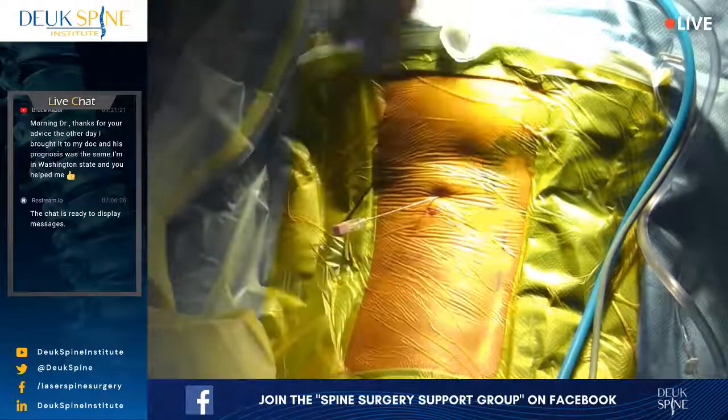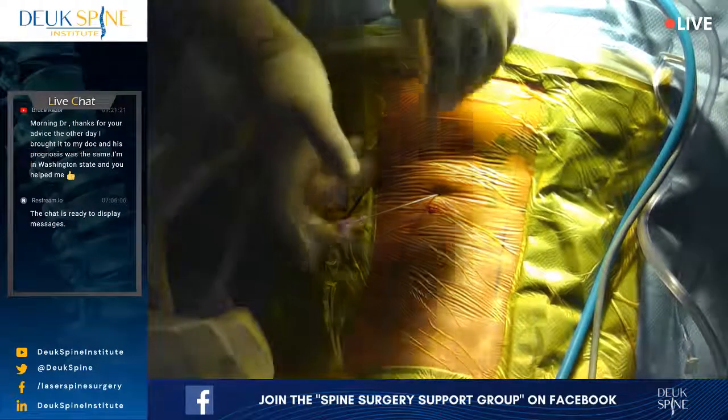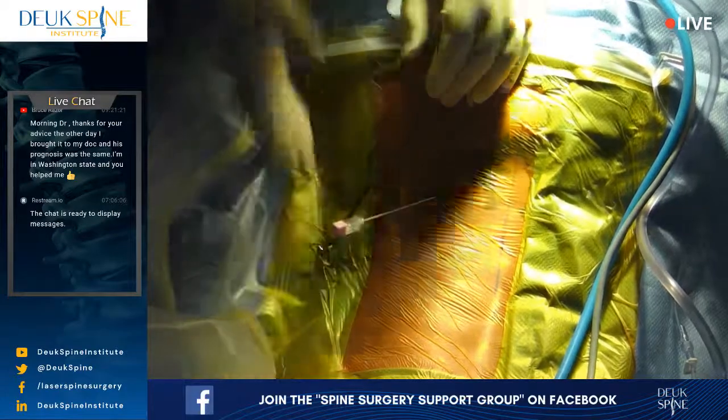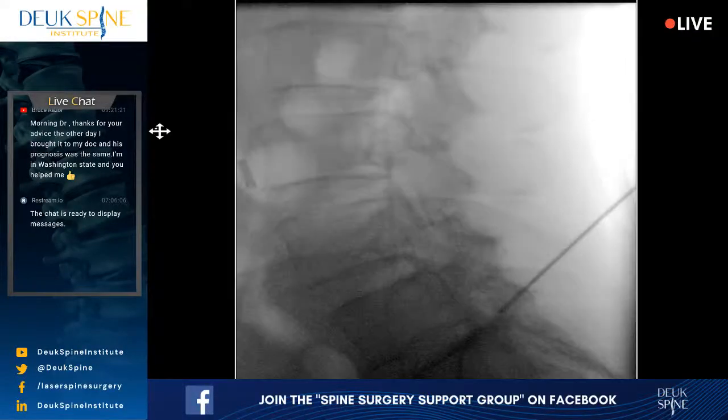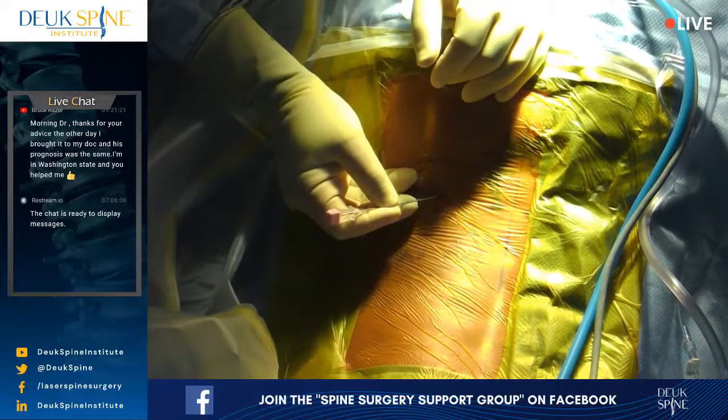Do you feel it in your back? You do? Yes. But not down your leg. Shot. So we're right at near the back of the disc. Where do you feel that? Okay, not down your leg. No. And that's where we are, right there.